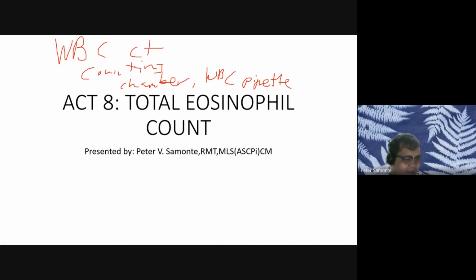What is the diluent of your WBC count, class? Do you remember? So, what is in Turk's fluid?